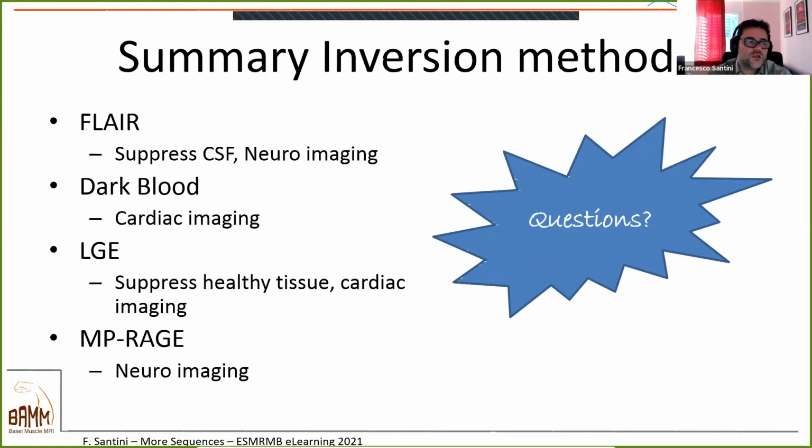Yeah, exactly. Usually you put a fat saturation pulse right before you do the acquisition. There are some sequences that use 2 inversions, but of course then the 2 inversions interact with each other, so you have to time them correctly. It's not trivial, and they're not really used for CSF and fat. They're more used to suppress fat and blood, which are closer.